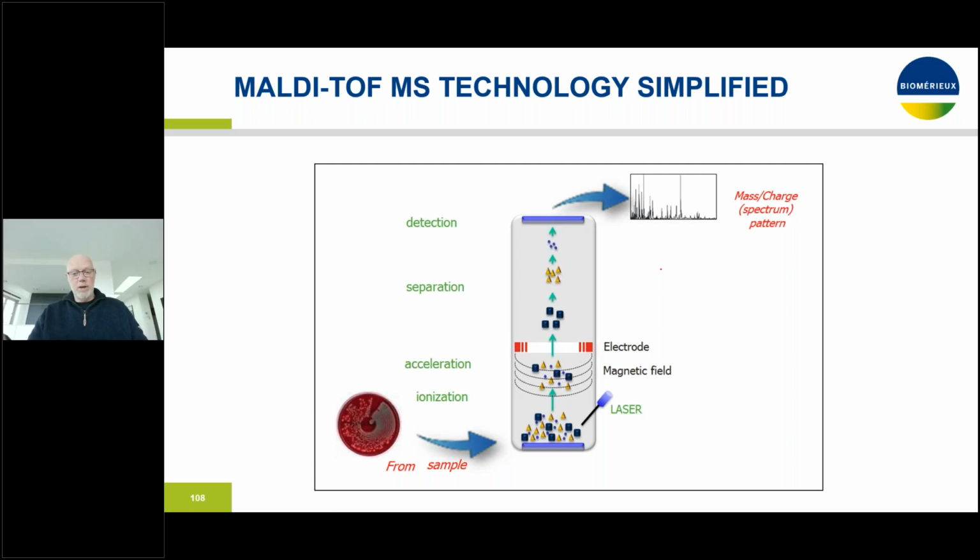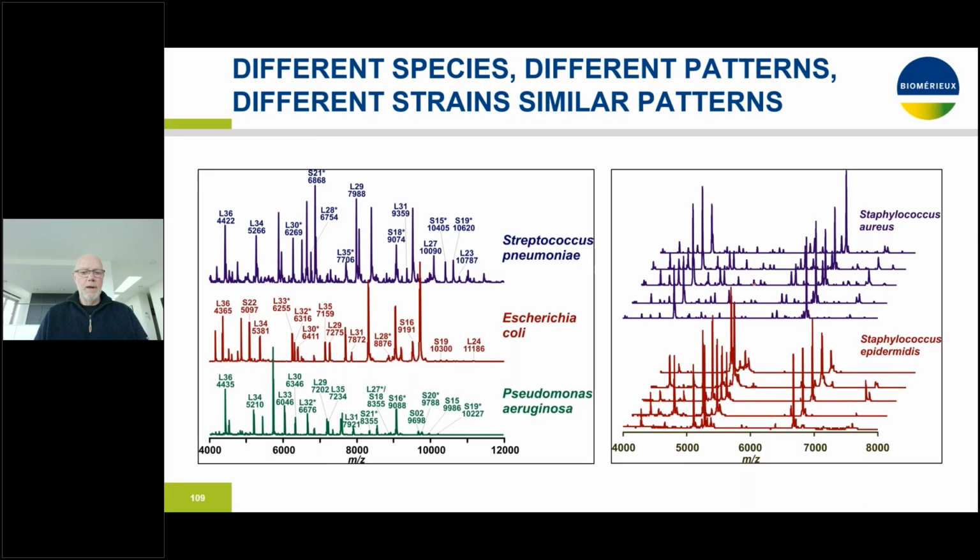So if you put in your sample, then you disturb the vacuum, which has, let's say, practical implications. You're not going to put a new sample plate into the machine every two or three minutes, because that's physically complicated.